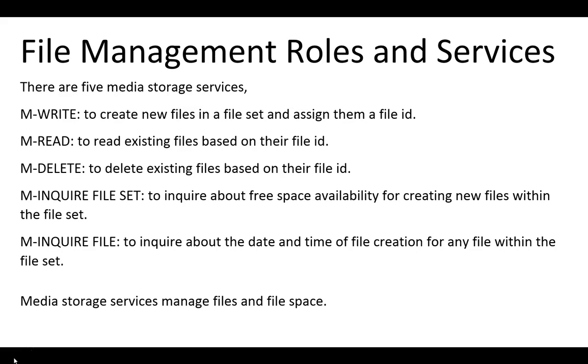So if I put a blank CD in the CT console and burn a patient study, the CT console is using MWrite to burn that CD. If it didn't work, I would check to see if the MWrite service was running. If I put a CD of a patient study they brought from someplace else into the CT console, it uses MRead to read the CD. If that didn't work, go into the PC services and see if the MRead service is running.